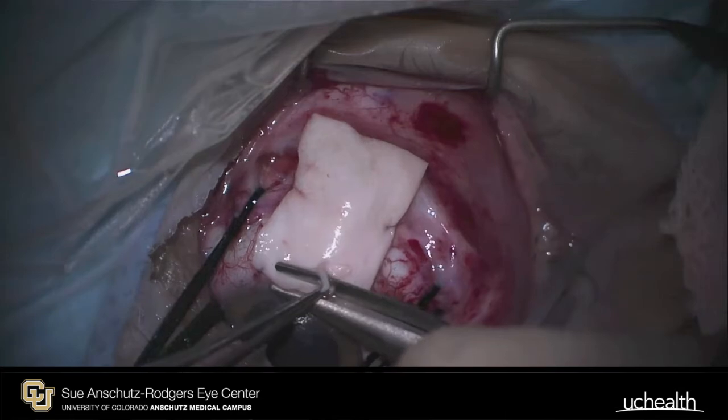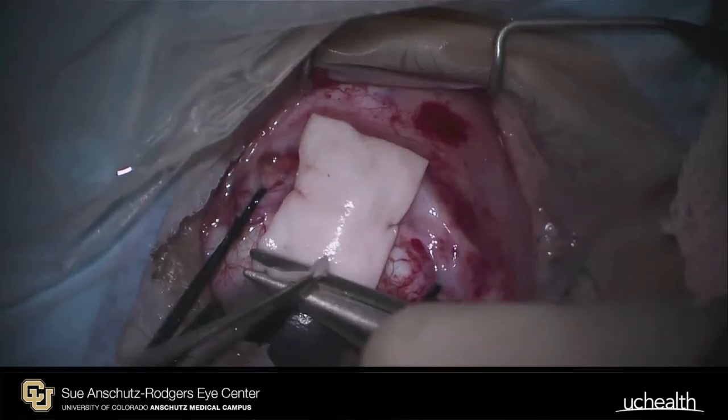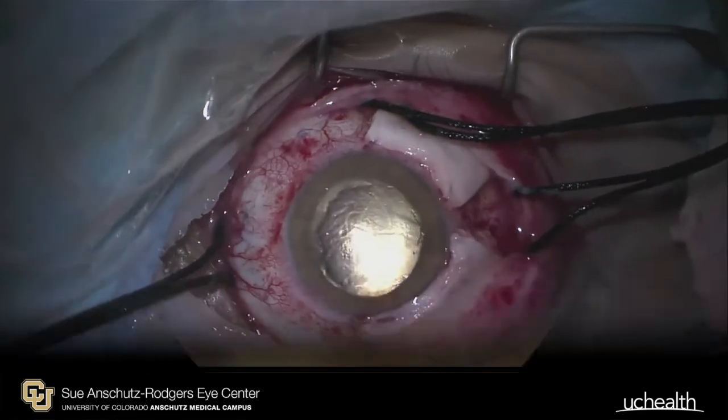Subsequently, silk ties will be removed and conjunctiva closed in a standard fashion, similar to scleral buckling surgery.